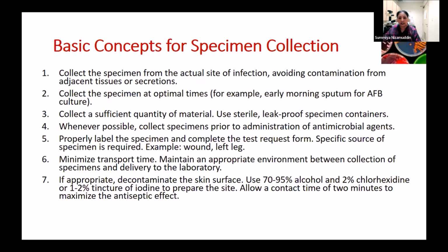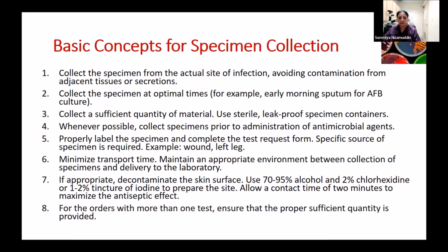So it's very important that the skin is appropriately decontaminated before the sample is actually drawn. And once again, if you're going to be ordering more than one test, please ensure that a sufficient amount of sample is submitted to the lab.